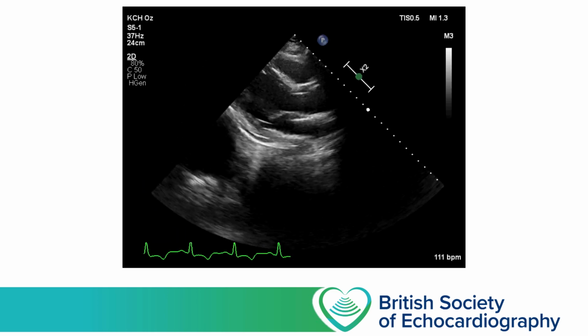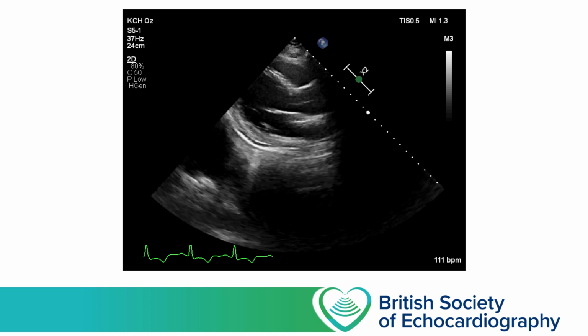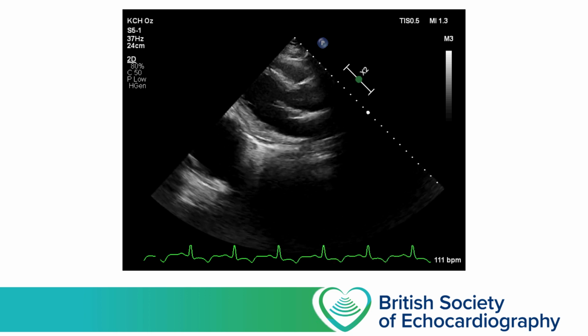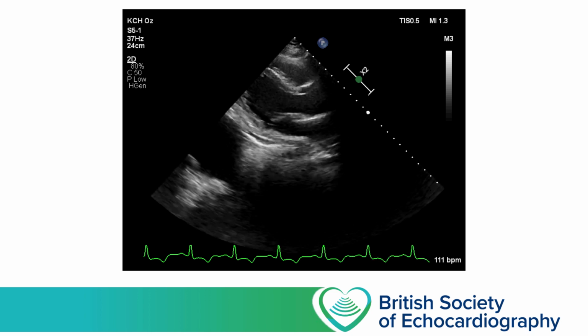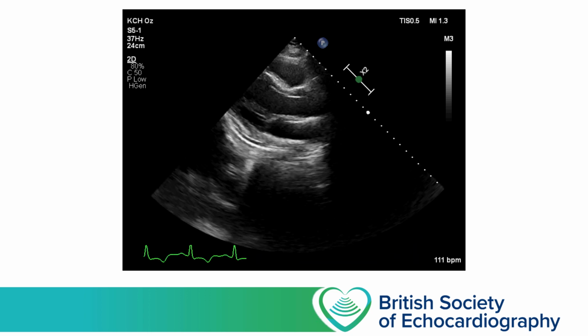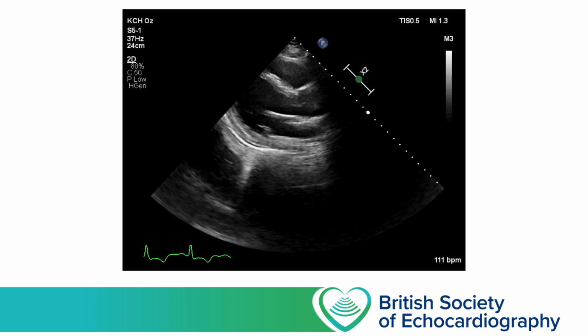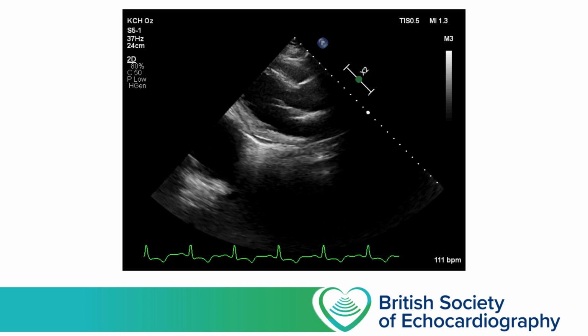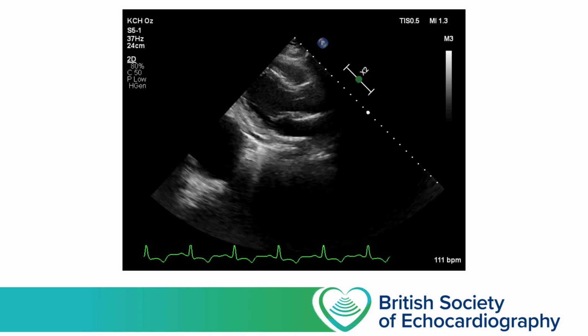This is a parasternal long axis view, and here you can see that the sector depth is set to 24 centimeters and the sector angle looks like it's around about 90 degrees. So we're asking the ultrasound machine to image a very large part of the body. Now if the area that we're interested in is the heart, then the bottom half of the image and the right hand third of the image aren't providing us any useful information. We're spending time sending ultrasound waves to parts of the body which aren't giving us any useful information back.